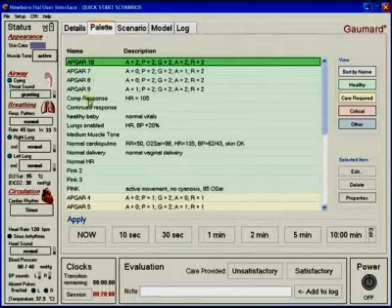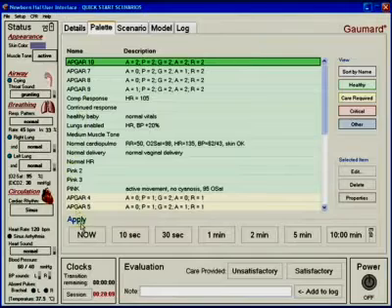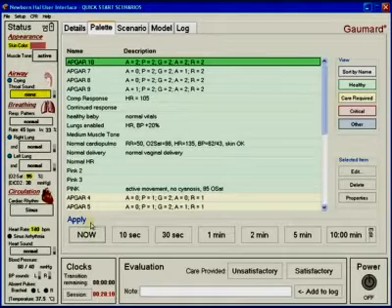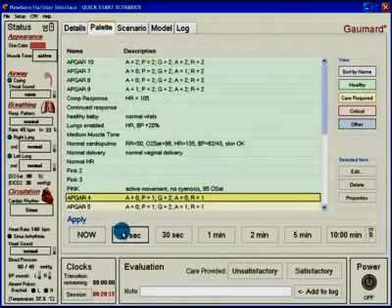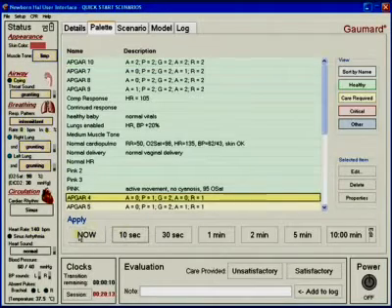As with the details, the palette items can be applied or saved to a scenario from the Scenario tab.